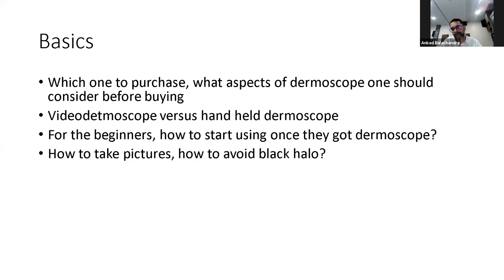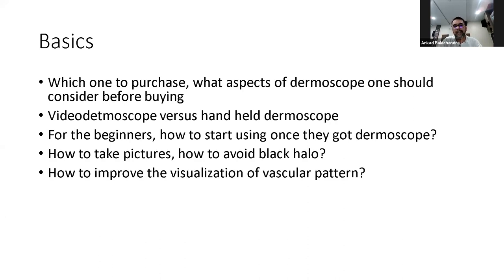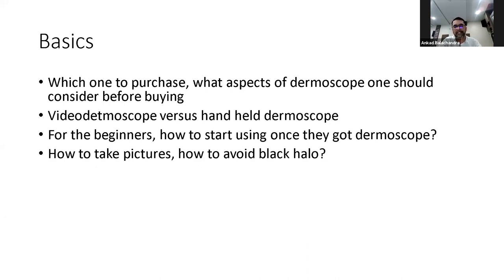One should have a dedicated attachment to the dermoscope to fix the camera. Earlier dermoscopes used to have that facility. Nowadays, all the hybrid dermoscopes are coming only with a universal adapter for the smartphone, and that will attach only to a smartphone. We cannot attach to a dedicated digital camera. I also suggest that whoever is starting dermoscopy should have a register. They should write the clinical diagnosis, time, and date when the images are captured.